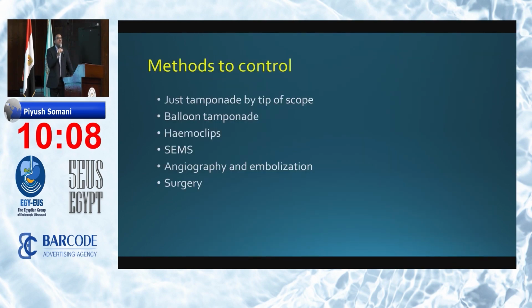How to control the bleeding if it develops? Unfortunately, maybe tamponade, but sometimes we need to go for angiography if it is a massive bleeding, depending on the control of bleeding.